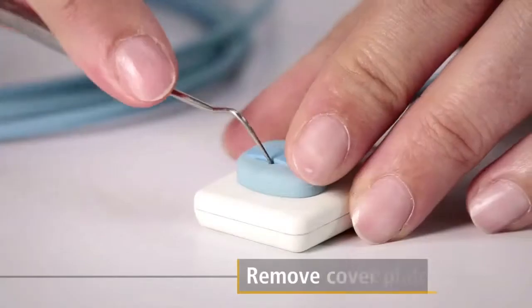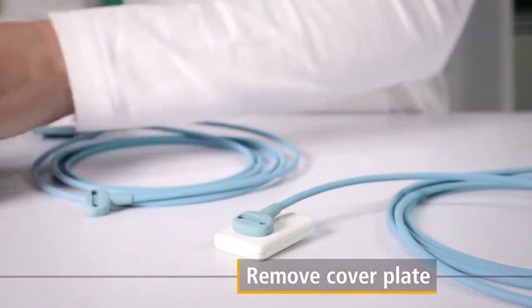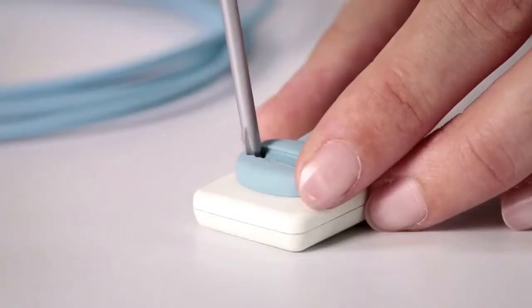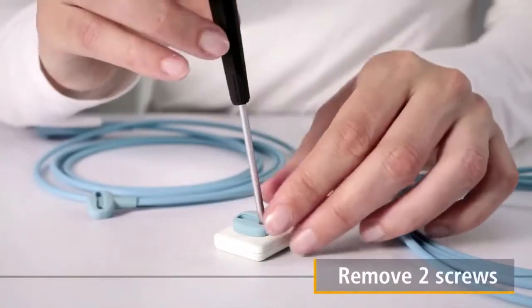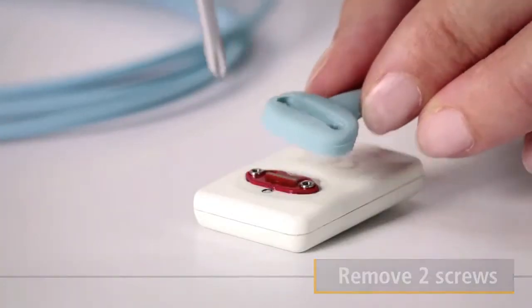First of all, use a scaler to remove the cover plate on the back of the sensor. The replacement cable kit includes a screwdriver, which can be used to remove the two small screws situated on the back. Finally, remove the cable.